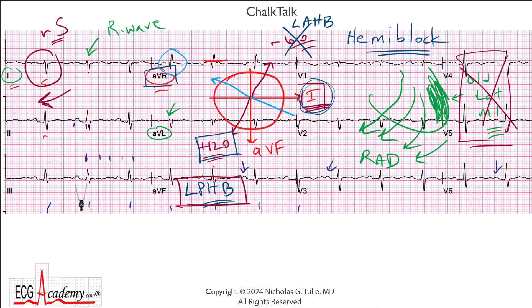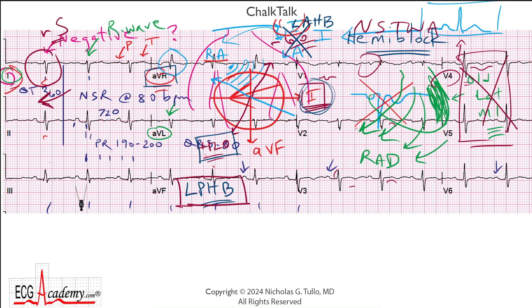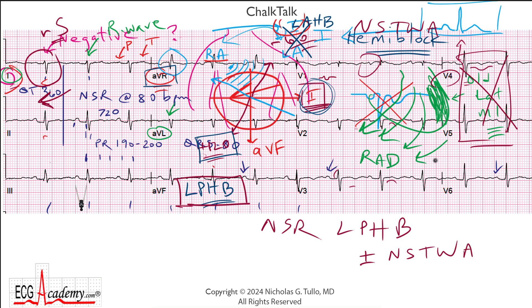Let's look at the precordial leads quickly. We can see the R-wave progression is okay — V4 is the point where the R wave grows taller than the S wave, so that's a pretty normal transition point. The T-waves do look upright, although one looks a little biphasic and funky. Some people would call these nonspecific T-wave abnormalities, but that's a very soft finding.